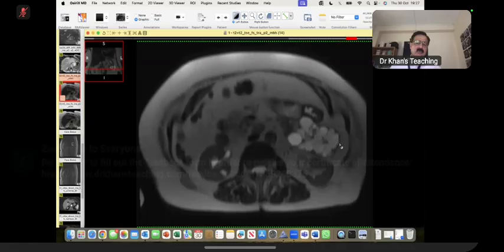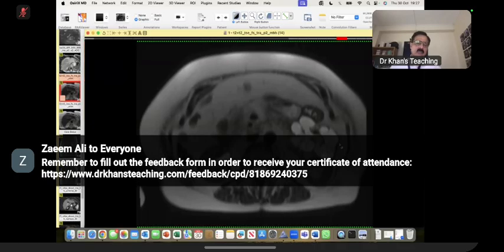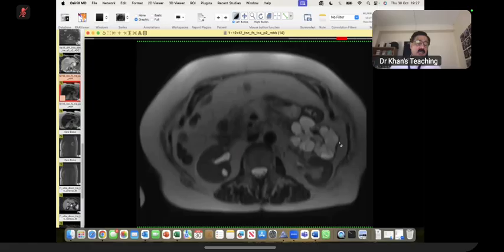In the end, once again, you kept in your differential diagnosis intraductal papillary. Actually, you had ruled it out, saying I can consider this, but there is no duct dilatation. Then in the end, you again kept it back. So please remember that in cystic lesions of the pancreas, we can do aspiration.